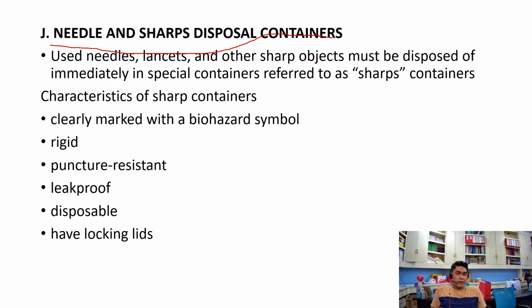Sharps containers are clearly marked with a biohazard symbol. They are rigid, puncture resistant, leak proof, disposable, and have locking lids.